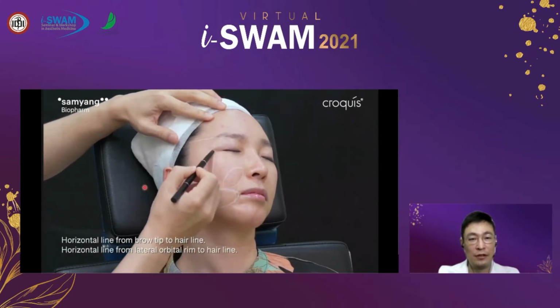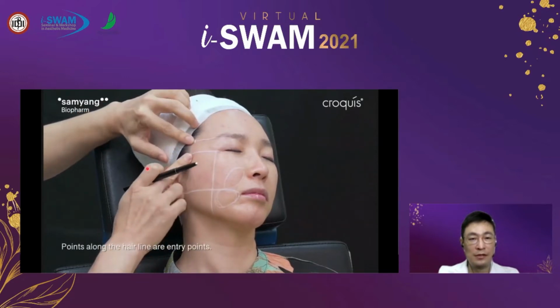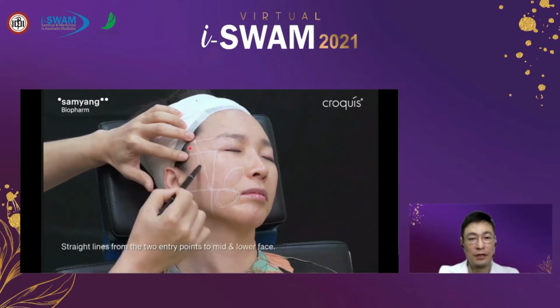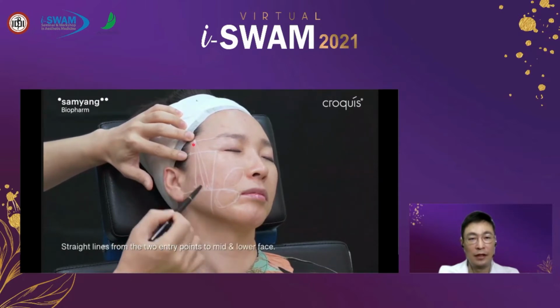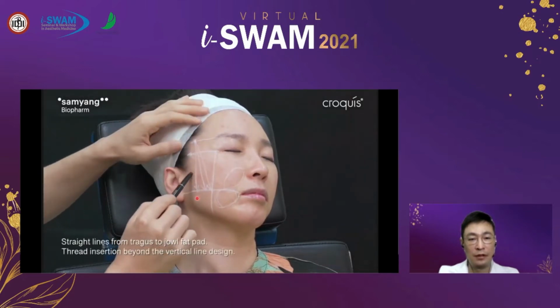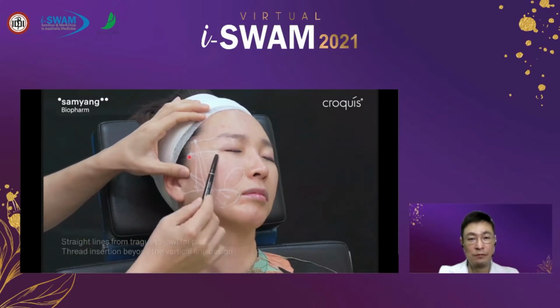Usually the entry points are made by these two lines crossing the hairline. The upper entry point will be used for lifting the lower face, and the lower one will be used for the mid-face lifting.